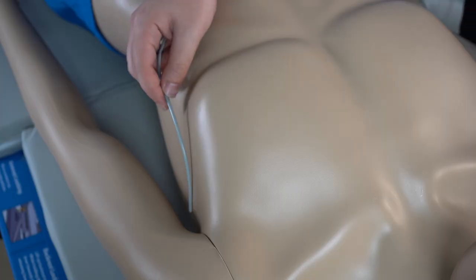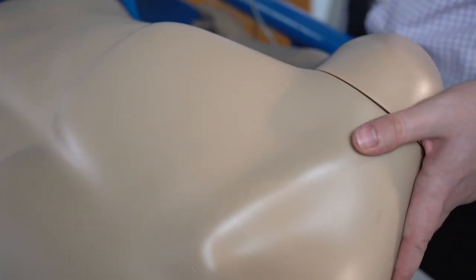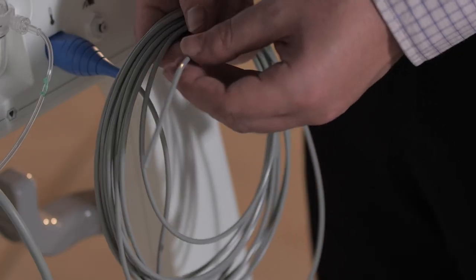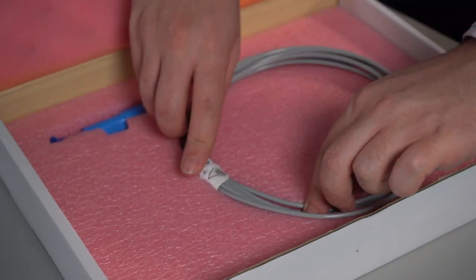First, choose where you'll place the thermometer sensor. It can read a patient's temperature in axillary, esophageal or rectal positions. If you're placing a sensor esophageal or rectally, make sure that it's protected by a hygienic, disposable sensor jacket. For an axillary reading, simply place the tip of the sensor against the skin of the armpit. Remember that the sensor is at the end of the cable. Like all fiber optic cables, the temperature sensor is sensitive to damage, so always be sure to package it carefully.